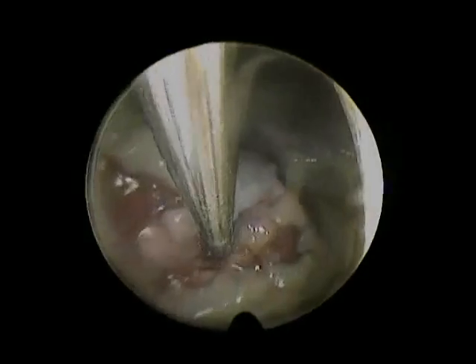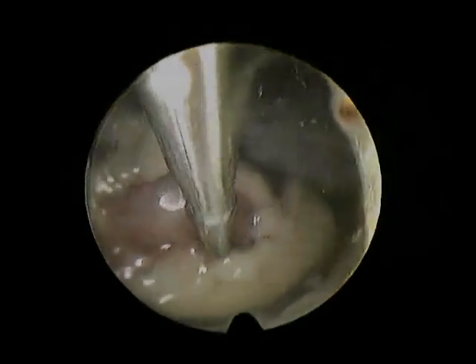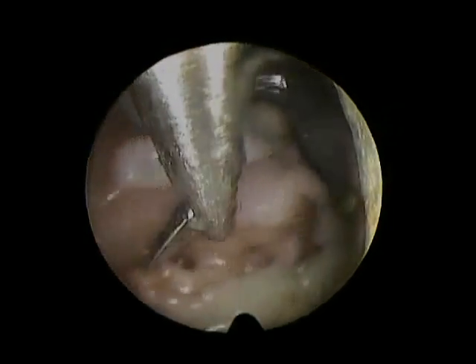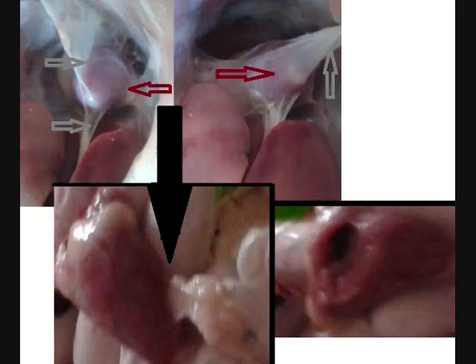So here's the heart, or the pericardium. I got rid of it. And then I imagined the heart like a kind of polyp, and I was cutting its big insertion base, just training. Again, that's not perfect. It's just about getting used to the scissors, for example. And that's the heart after the operation. See, there was no pericardium, and it was open.